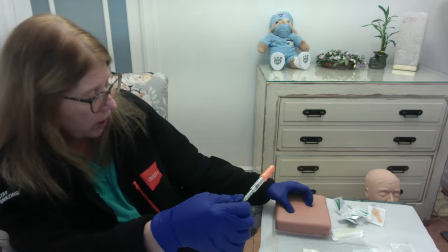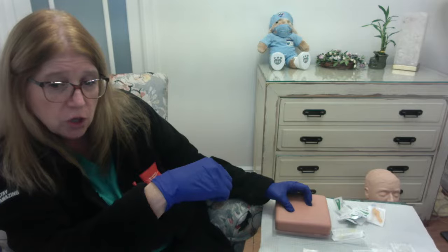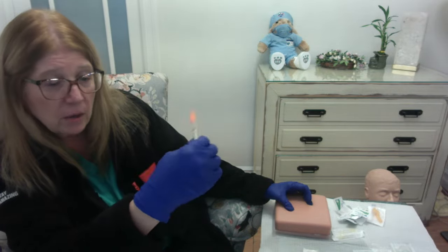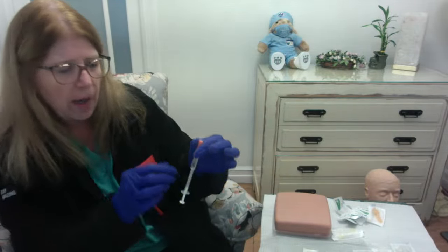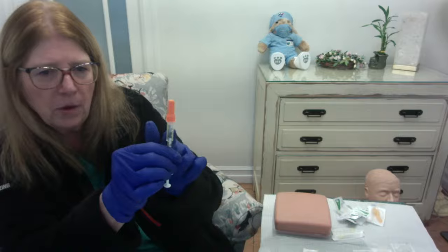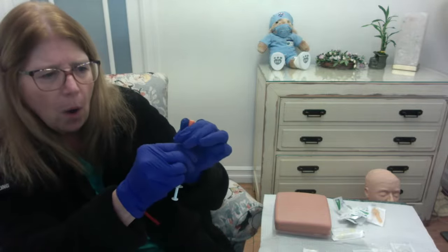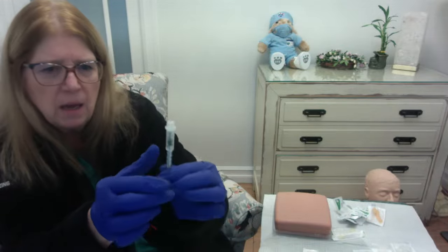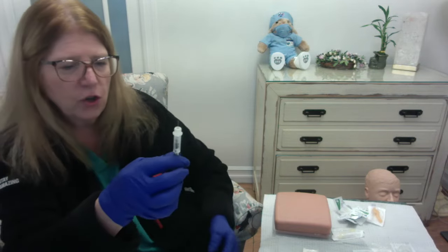If you're pinching the skin and you give an injection and you take the needle out and you're still pinching the skin, you're going to be squeezing that medicine out of the skin. Your patient's not going to get their full dose. All right, so this is nice and dry. And remember I told you with this needle, because of the sleeve here, you've got to hold on to the sleeve while you pull your cap off, okay? And again, very short, tiny needle for this insulin injection.